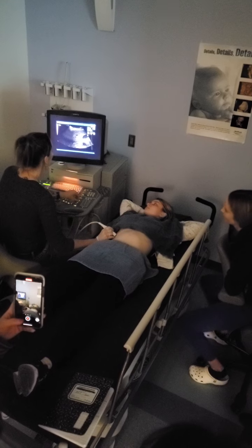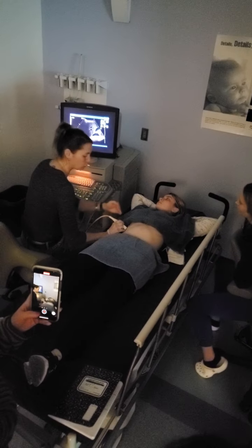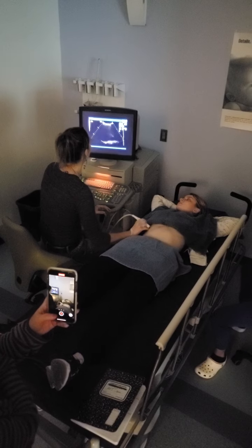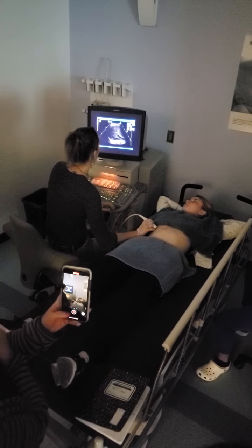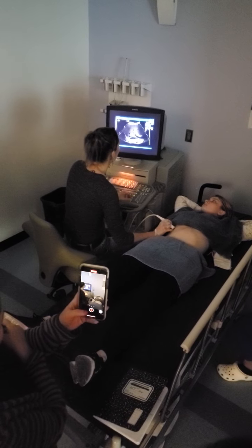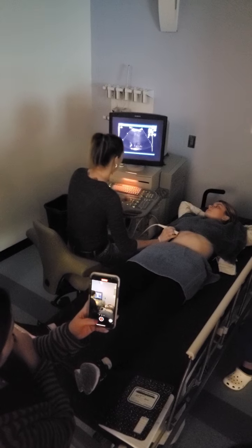Everybody's going to have a little bit different angle, but they should angle towards the belly button, if that makes sense. As you're approaching, angle towards the belly button. Pop up a rib space. Are you seeing anybody that looks convincing? Maybe? Yeah. Okay.